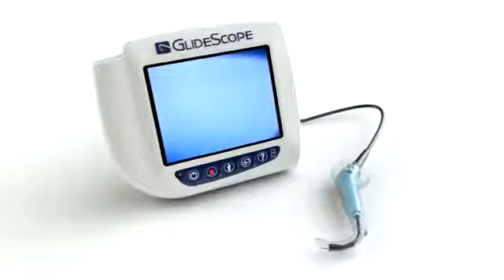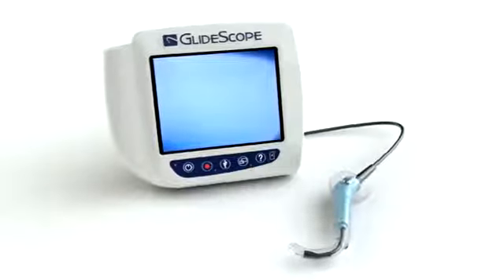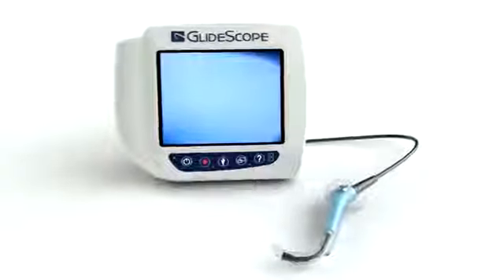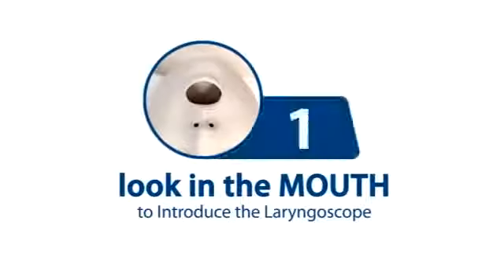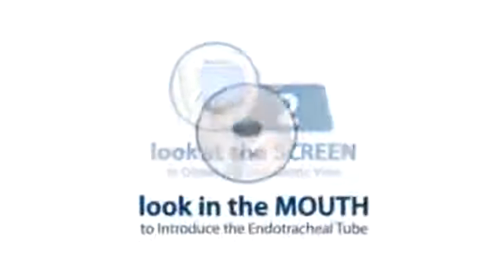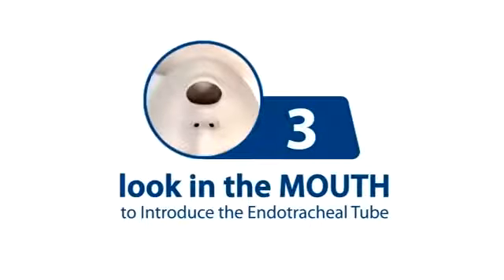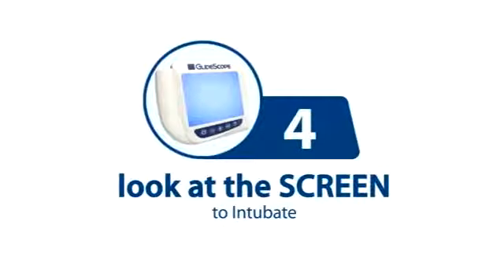The basic technique for successful pediatric intubation with GlideScope video laryngoscopy combines direct vision of the patient with views on the video monitor. Look in the mouth to introduce the laryngoscope. At the screen to obtain the best glottic view. Back in the mouth to introduce the endotracheal tube. And finally, at the screen to intubate.